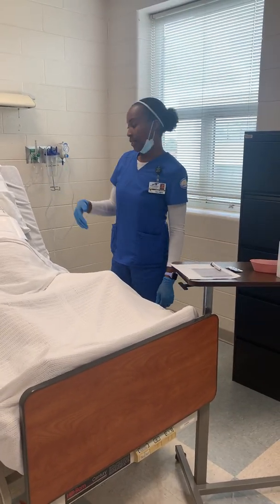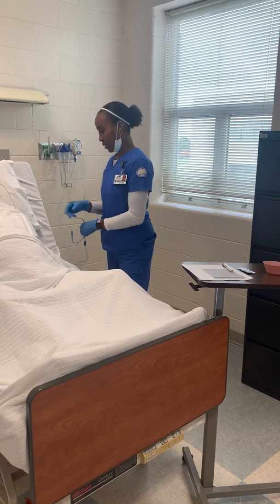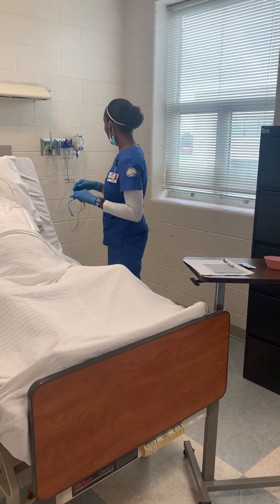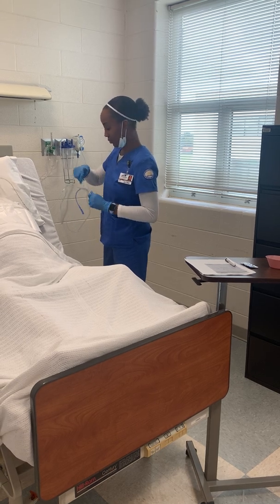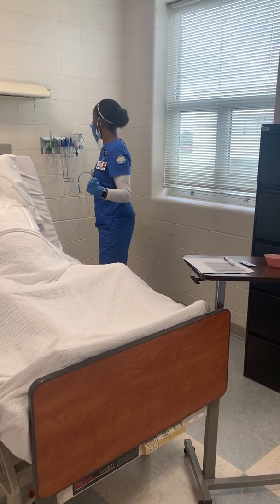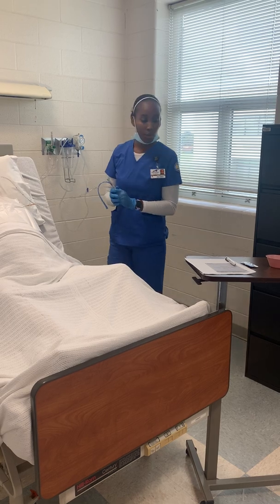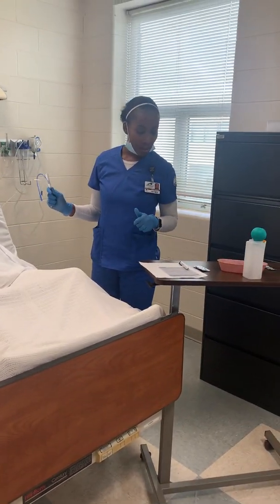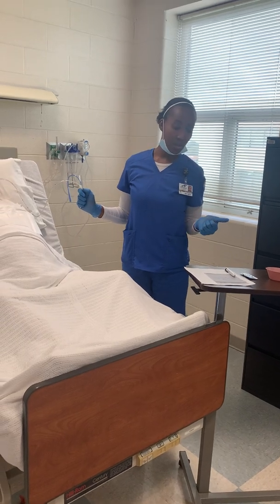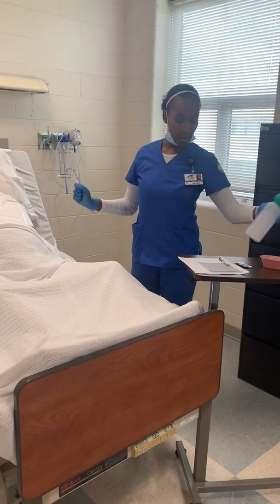So we know it's in the right spot, so I'm going to go ahead and disconnect. Turn it off. And according to the order, we need to use 0.9% normal saline. So here's my saline.